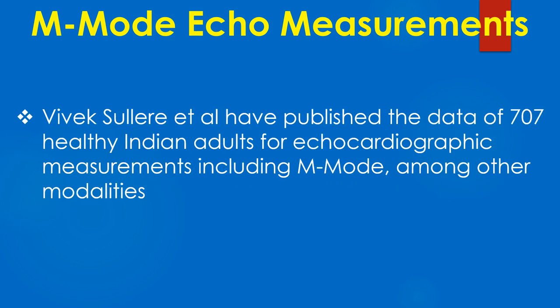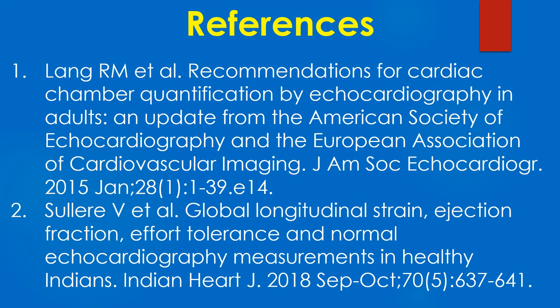Vivek and colleagues have published the data of 707 healthy Indian adults for echocardiographic measurements including M-mode among other modalities. Here are a couple of references on M-mode echocardiographic measurements.